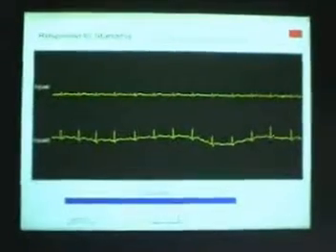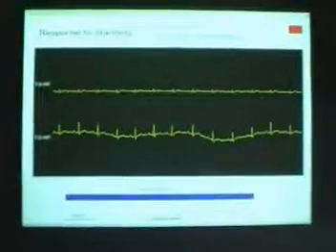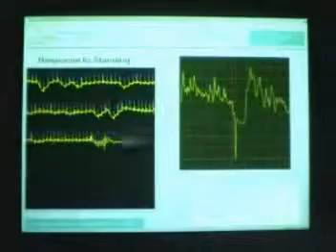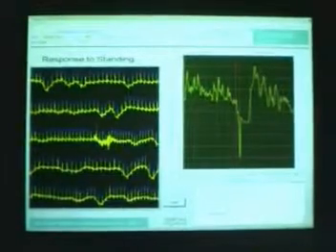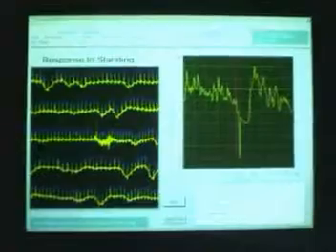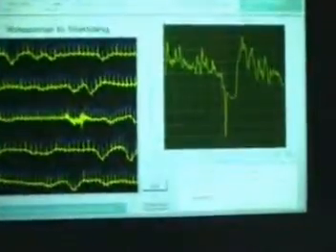This recording for ECG goes on for the entire 1 minute, and once the entire recording is complete, the test is aborted. Again, here you can see the average RR interval is obtained, the coefficient of variation is obtained, and the 30:15 ratio is also obtained, and the test result is normal.